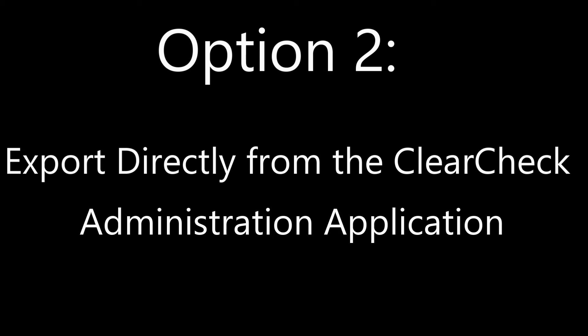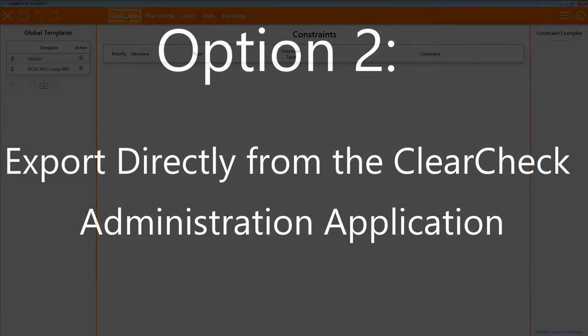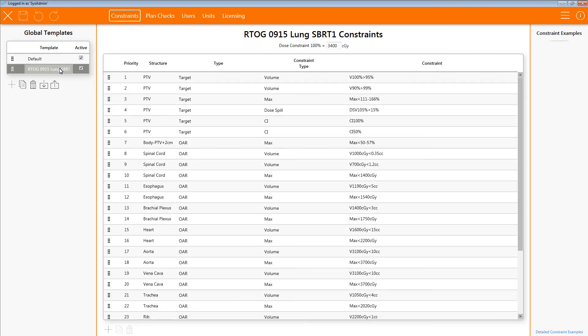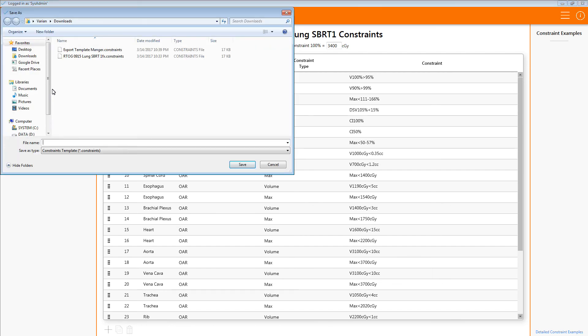You can also export the constraint template via the administration application. Again, you will need the proper rights in order to launch the ClearCheck administration application. Once launched, make sure you are on the Constraints tab. Find the constraint template you wish to export. Now click the Export button located here. Then just save the constraint template to a location on your hard drive.